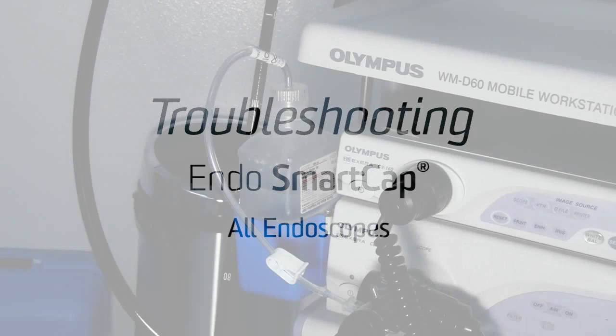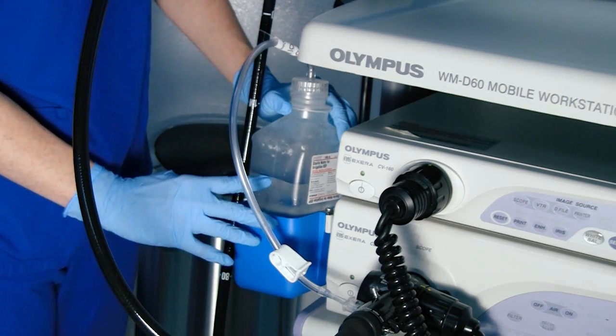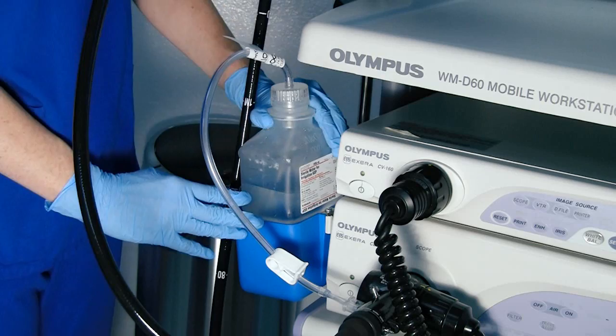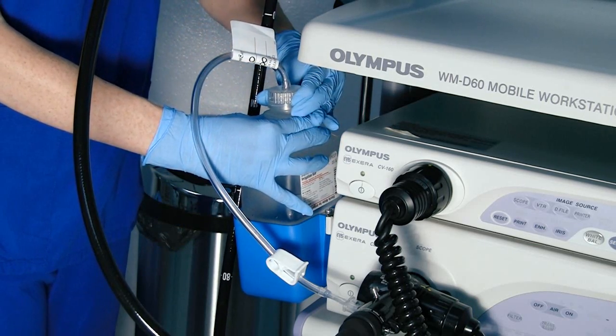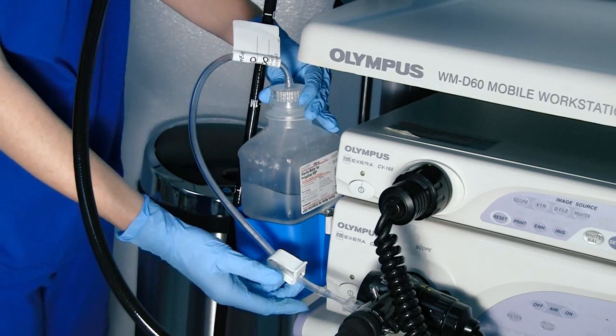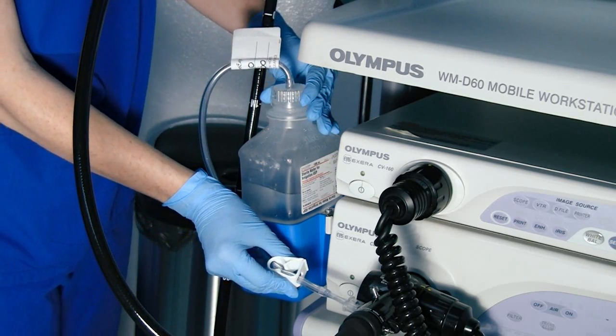When troubleshooting the Smart Cap, the first thing to check is to make sure you have enough of a pocket of air at the top of the water bottle. Next, ensure that the Smart Cap has a tight seal onto the sterile water bottle. Lastly, check to make sure the pinch clip has been released and is not pressing onto the tube lumens.